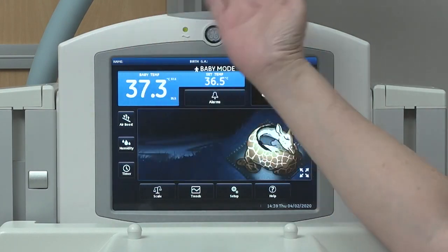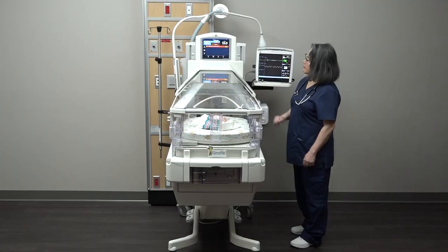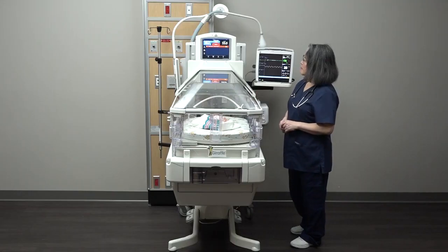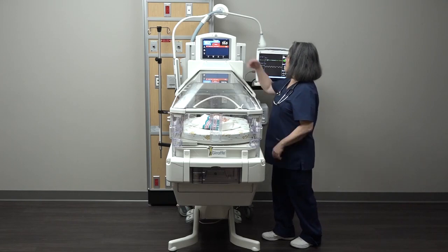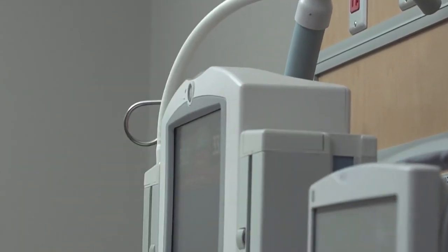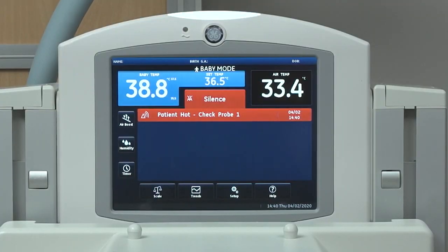Remember, there are two ways to silence an alarm. For hands-free alarm silence, move your hand two to six inches directly in front of the hands-free alarm silence sensor. You can also just press the alarm silence button on the bed screen as well.